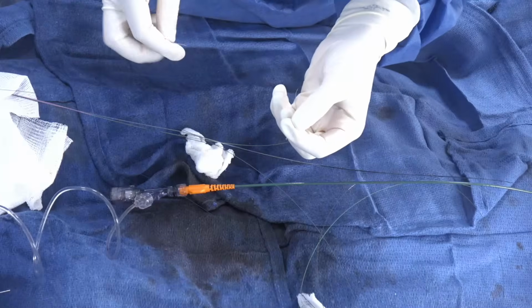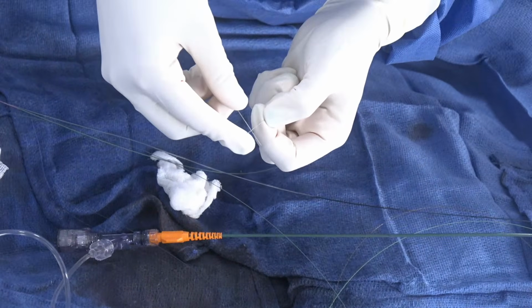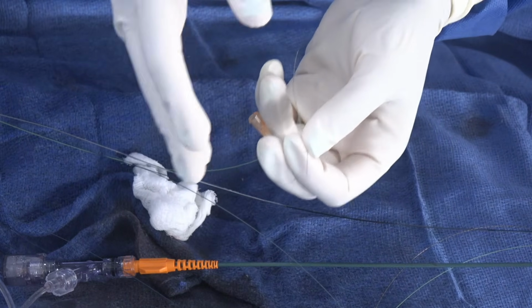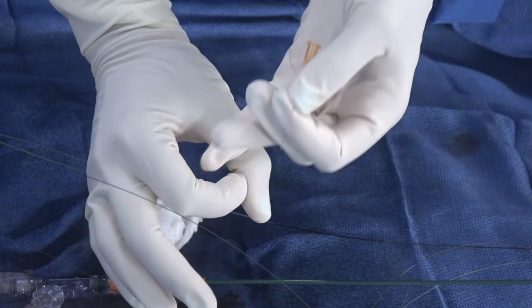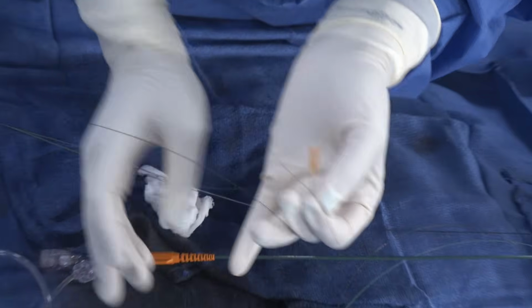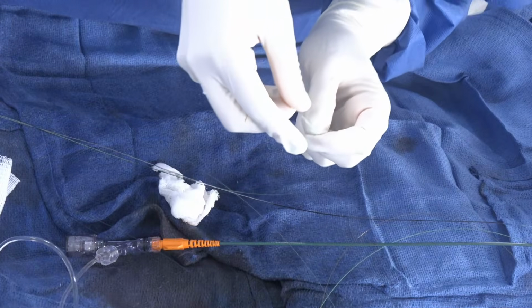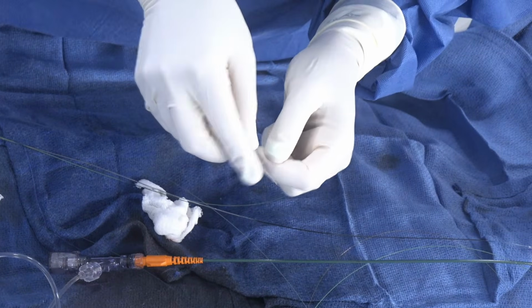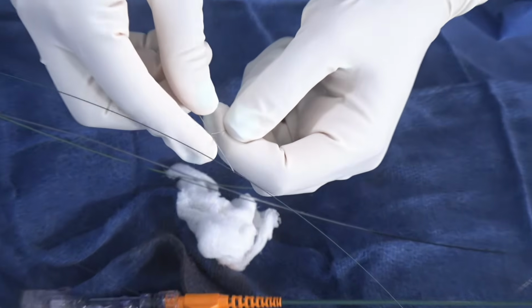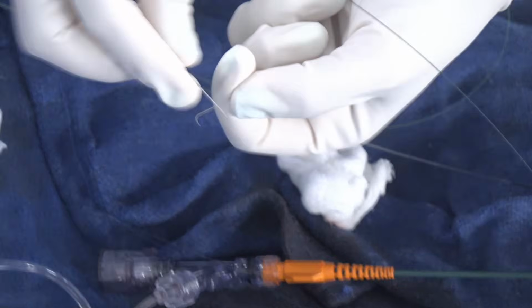So why is it important that you go back to the hydrophobic tip wire when the hydrophilic wire is the first thing that you think of? Since it's hydrophilic and you have the stent strut and you have to go through the stent strut into the side branch, you think a hydrophilic wire will easily find its channel. But in this case, because of the calcium, just being a hydrophilic wire did not make the effort. So we definitely needed a hydrophobic wire, because a hydrophobic wire will keep the curve, so this is the kind of curve you would like. You see that? Are you able to see it now?